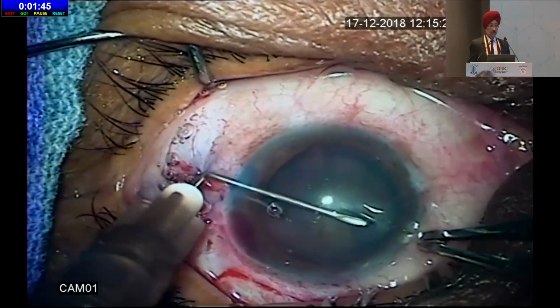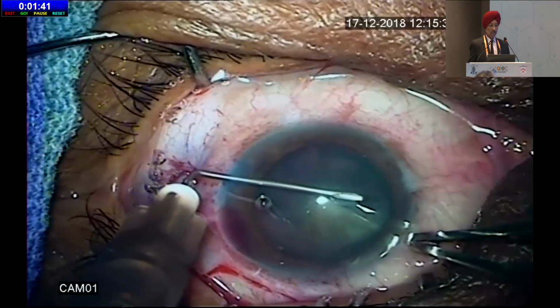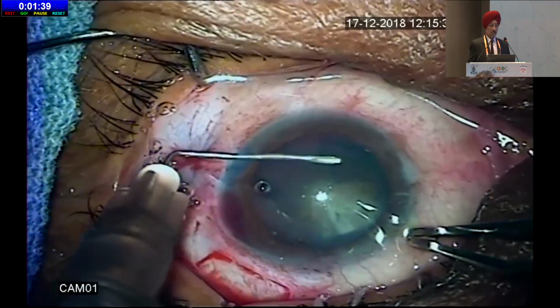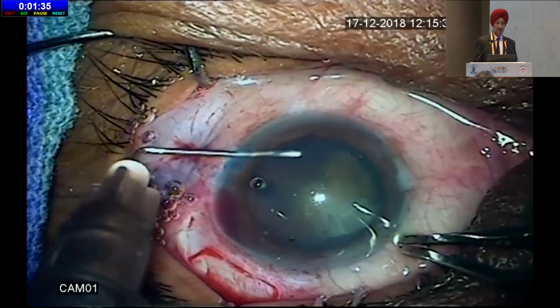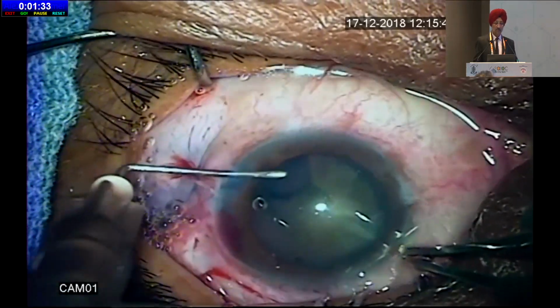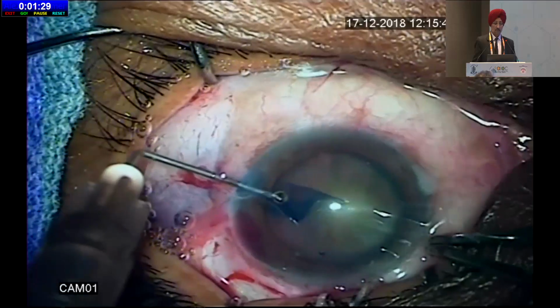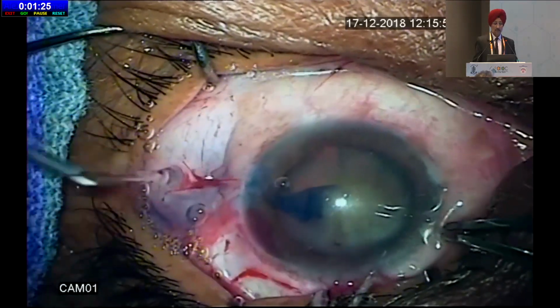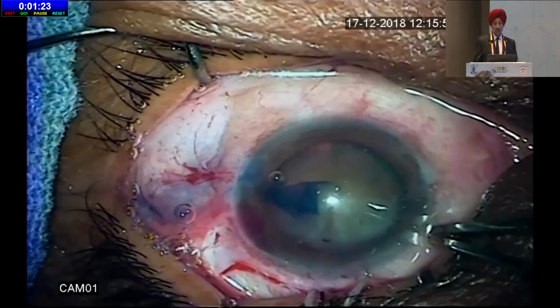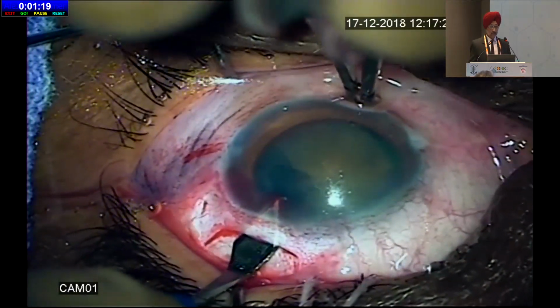If rhexis tries to extend in such cases, it has to be detected early, as once it crosses the line of control there is no rescue. And we can't afford extension beyond the equator in any case, especially in diabetics. This aids in easy prolapse of the nucleus-epinucleus complex without any stress on zonule or compromise to the posterior capsule. Main entry is made with a 2.8 mm keratome.